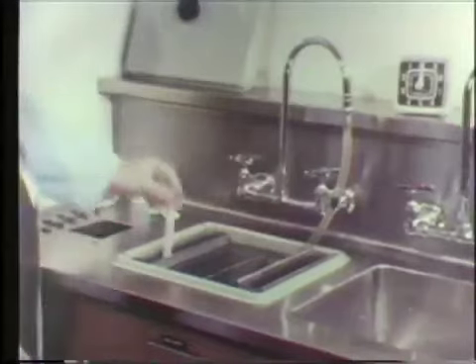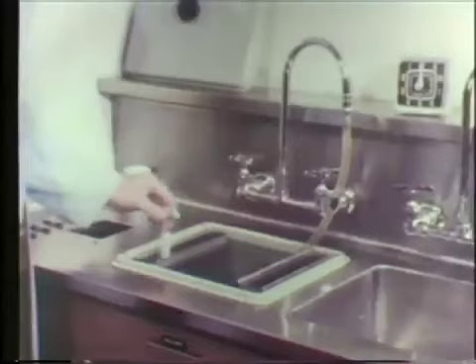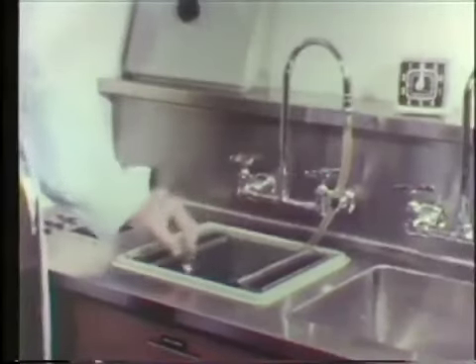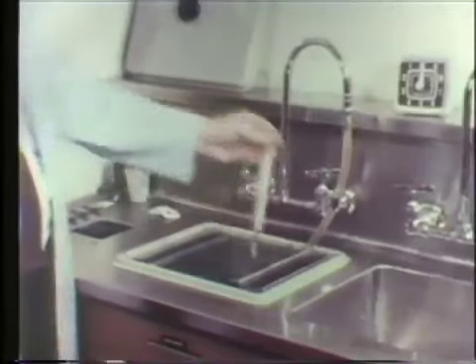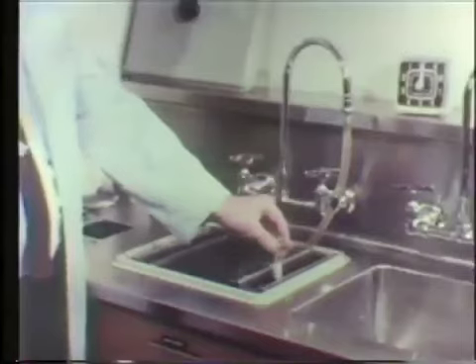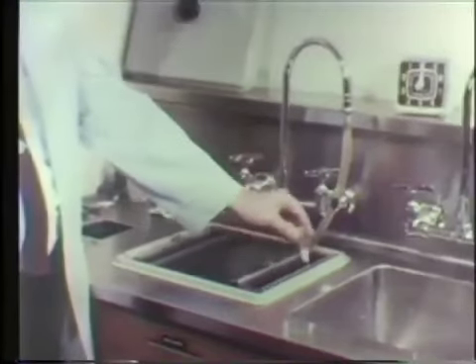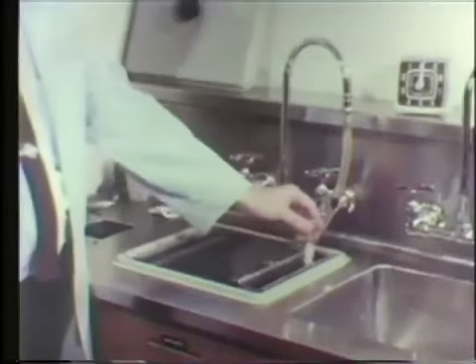Now we'd like to agitate the fixer so that it's uniform in concentration and also in temperature. We're using the thermometer as a stirring stick. There we rinse it clean in the water before we place it in the developer. Now we're stirring the developer, and we're also going to take the temperature of the developing bath.